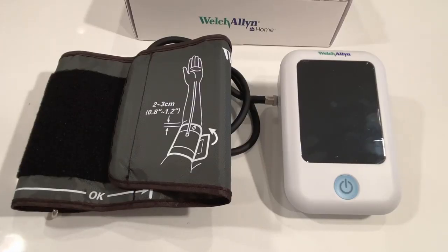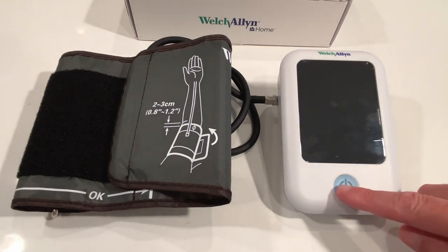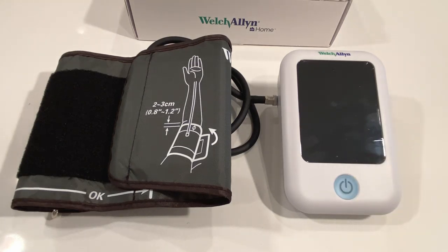The monitor is ready to go and all you have to do is press the power button and it will start measuring your blood pressure, which we will do in a moment.